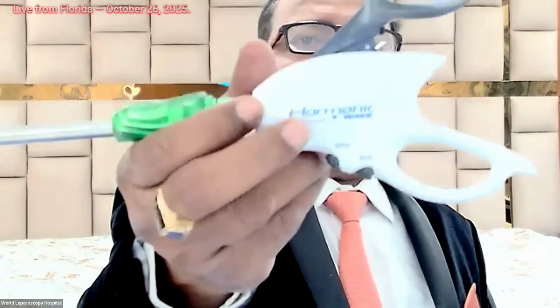Suppose you want to do a vaginal hysterectomy or LAVH or open surgery, then you have the harmonic wave. You can see it is written here, harmonic wave. This harmonic wave also you can attach to the same transducer, and then you can apply it like that. You have to tighten it 2 times. After fixing it, there is a tightener, and this is 1 and 2. It will give you 2 clicks, and after that you can use it.